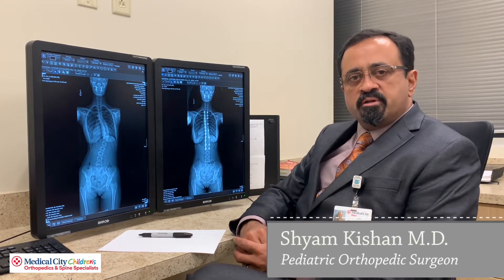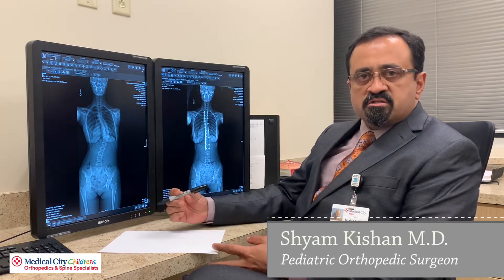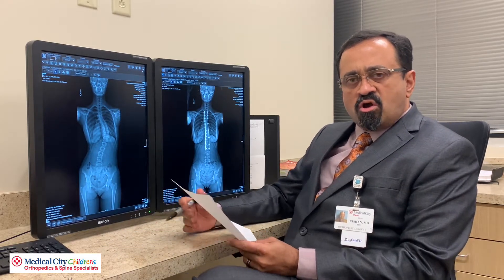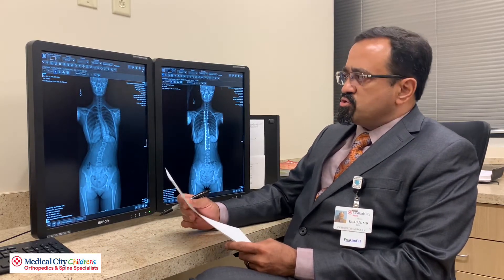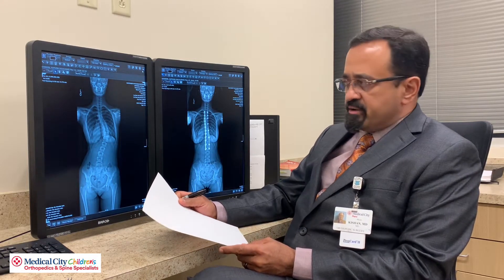Hi, I'm Dr. Kishan. I'm going to talk to you a little bit about vertebral body tethering. Vertebral body tethering is an interesting, fairly new concept on how to use the body's growth to help correct a deformity.